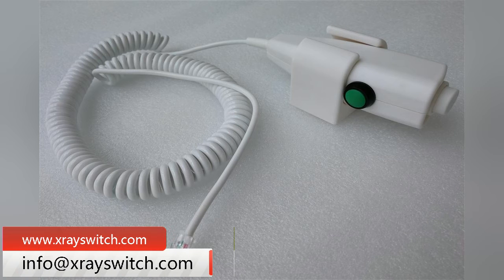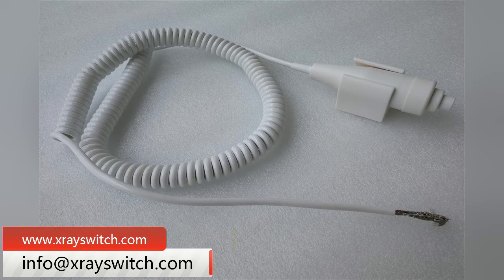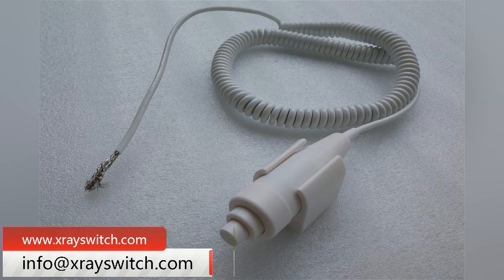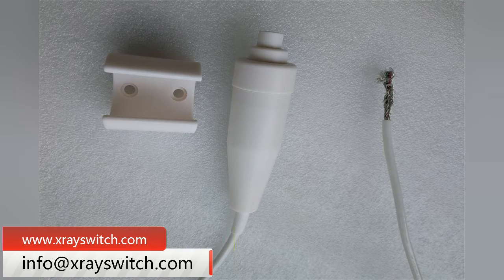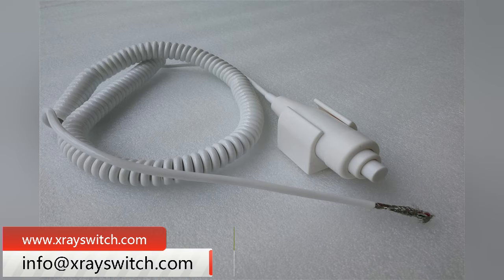A client consulted about the exposure handbrake switch for the MIKASHF 100H bedside x-ray machine in Mikasa, Japan. This is a customized handbrake switch with special design. When making a customized handbrake switch, we need to customize it specially according to the original product. In general, customers provide us with product information, and our engineers can customize it specially for you.